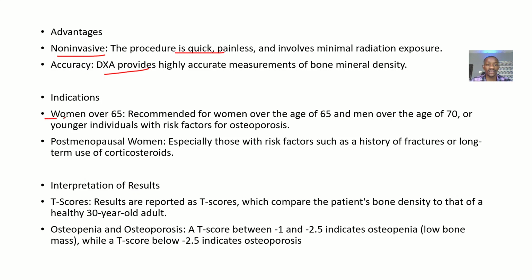Indications: it is recommended for women over the age of 65 and men over the age of 70, or even younger individuals who have risks of developing osteoporosis. Postmenopausal women. It is indicated in women with risk factors such as a history of fractures or long-term use of corticosteroids.